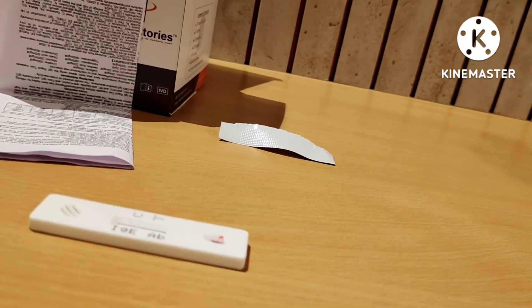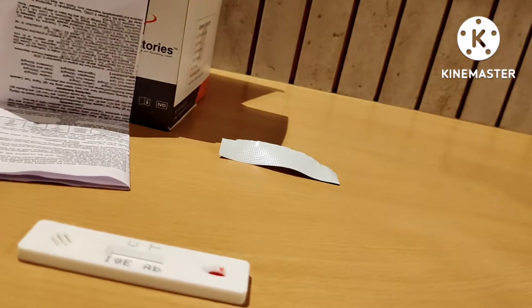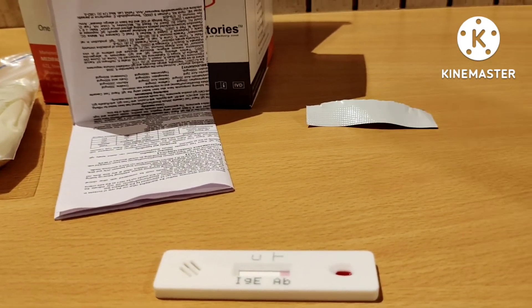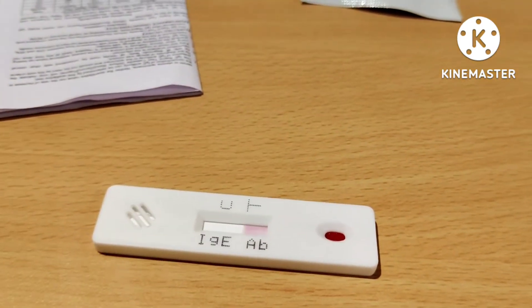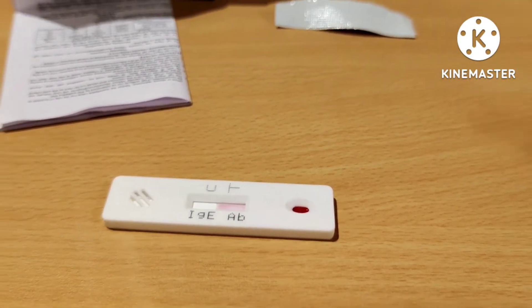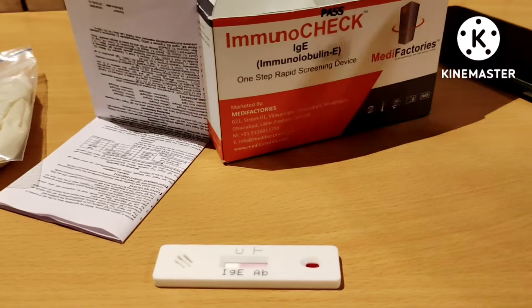And add one drop of buffer. Let's start the timer — it is 2:38 now. You can see the sample has started to flow already. We have to wait for 5 minutes for a band to appear.